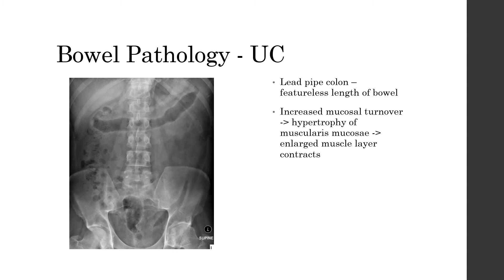Another potential pathology is lead pipe colon in UC, caused by chronic inflammation and increased growth of the muscularis mucosae, which contracts and generally removes any features from that length of bowel.